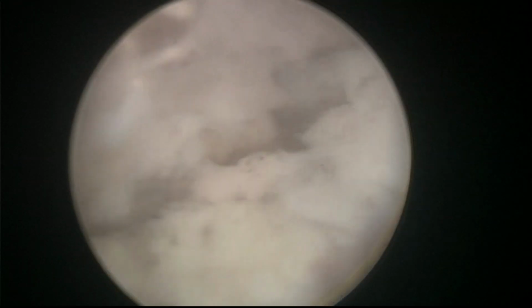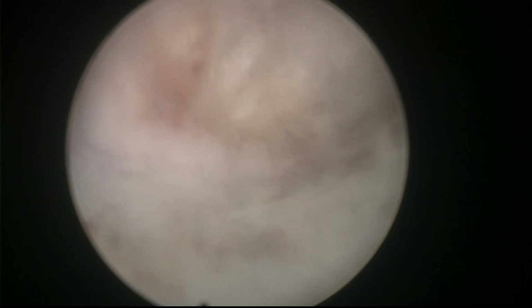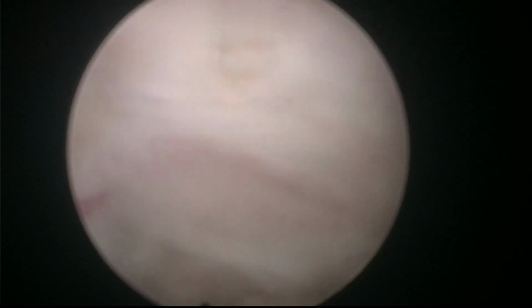So you see, approaching the anterior carefully. Okay. Almost there, I think. It's a relatively difficult anterior plane, but we are getting there. I think we are succeeding to take the anterior tissue. Normally you wouldn't have such limitation in a normal patient, but this is an obese patient, so the mobility of the scope is limited, and that's why we're having more trouble accessing this. I think it's looking good. We will check at the end.